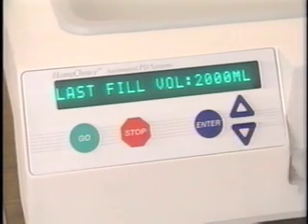The fourth is last fill volume, which is the volume of the last fill to be delivered at the end of the therapy and left in the peritoneal cavity during the day. This will vary depending upon the therapy. Press the down arrow again.